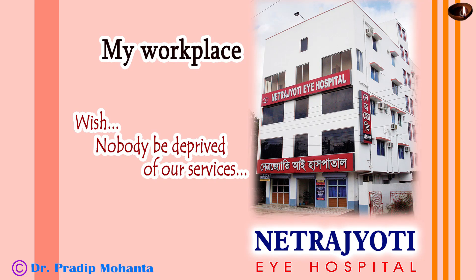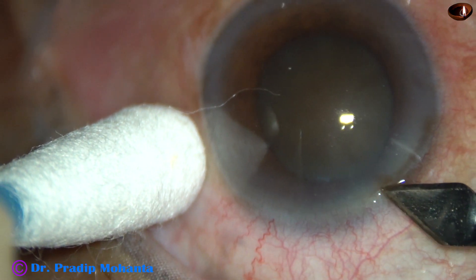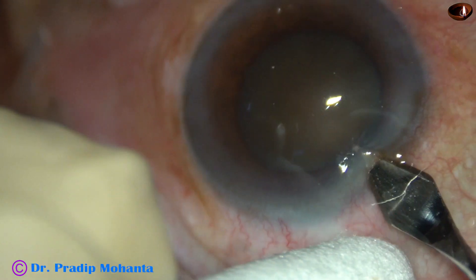Friends, welcome to my workplace at Rana Ghat, West Bengal, India. This is a hard cataract with grade 5 nuclear sclerosis. Let us observe this surgery.